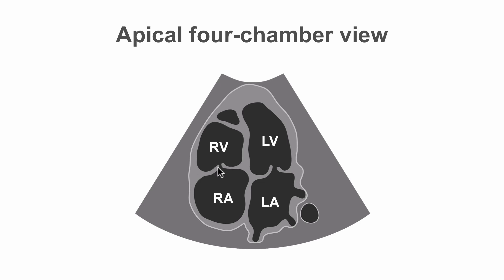This is the tricuspid valve. In a normal heart, the left ventricular apex forms the apex of the heart. If the right ventricle becomes dilated, it can push it over, but this is a normal situation we're looking at here. We've got three of the four pulmonary veins coming into the left atrium, and then this circular structure outside of the heart, outside of the pericardium, is the descending aorta.